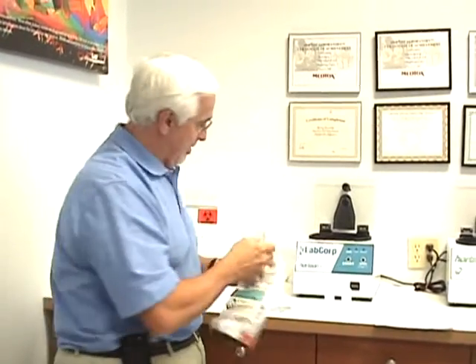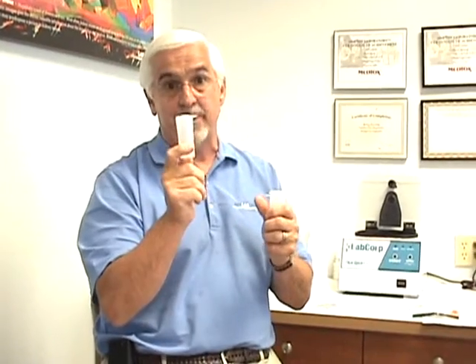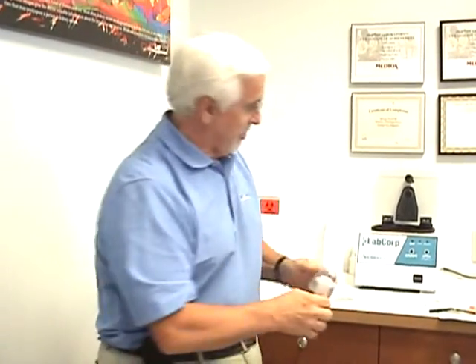The contents of the kit will include a transport bag, and it will include, depending on the test that you've chosen, either 1 or 2 containers. This test that I've chosen is a 2-container kit. These containers have a fail-safe lock on them that you can inspect to make sure that they have never been opened before. Again, protect yourself, make sure that you're getting a virgin kit that hasn't been used before. The employee will then ask you to empty your pockets.